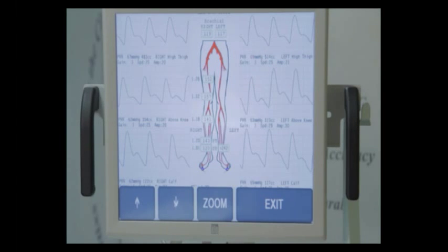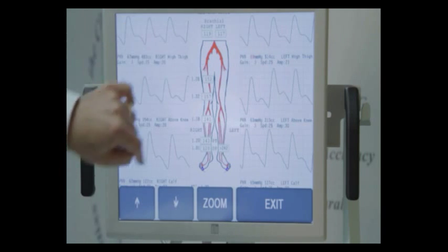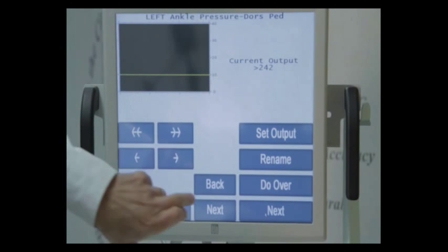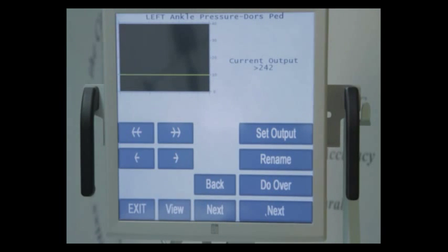I'll also take this opportunity to demonstrate the view function. At any point in your examination, you can press exit and view, and then you can see what you've done up until this point. You can see if you want to redo something. I usually redo something after I've completed my study. Right now, I'm going to go back to where I was by pressing exit and then back.